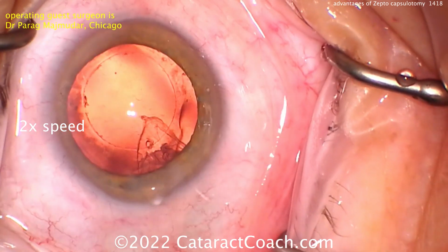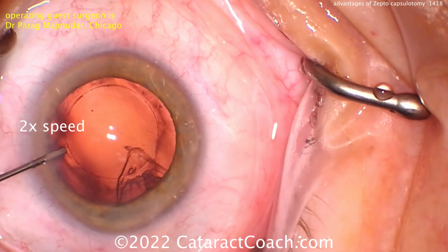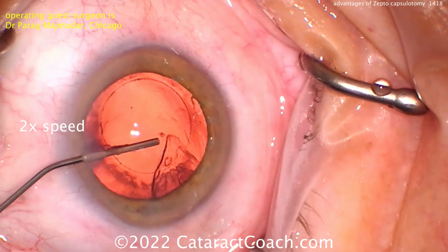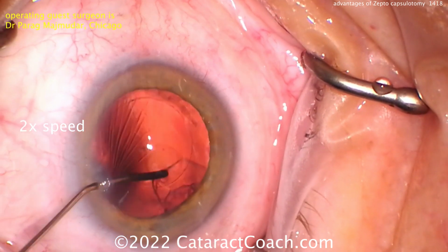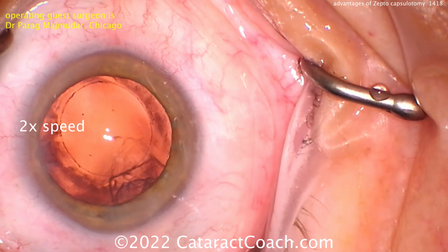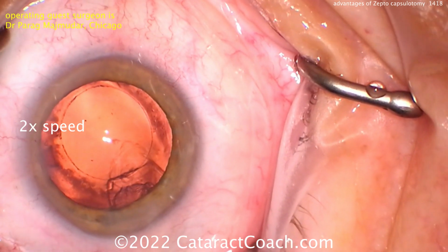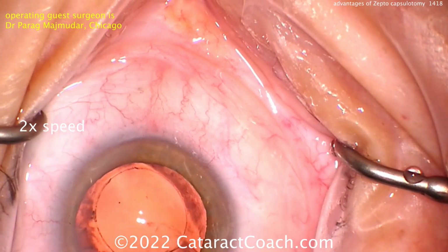You can imagine a case that's with an intumescent white cataract that we talked about, but what about loose zonular support? There are cases where you'll struggle to make the rhexis because when you get in there, the capsular tissue is so loose. Well, here's a way of making your capsulotomy instantly without any issue. You don't need that counter traction. You don't worry that the capsular bag is wrinkling, etc.